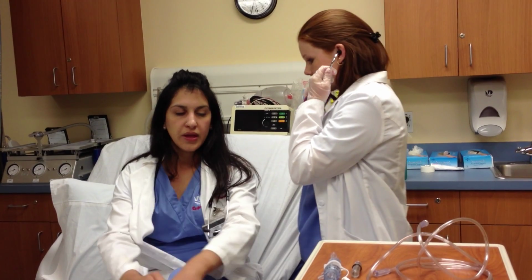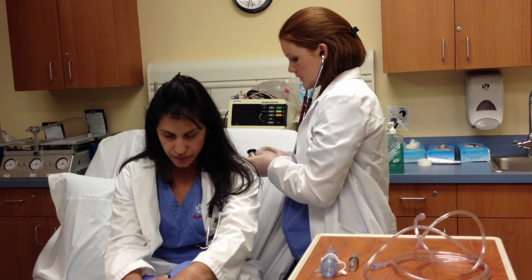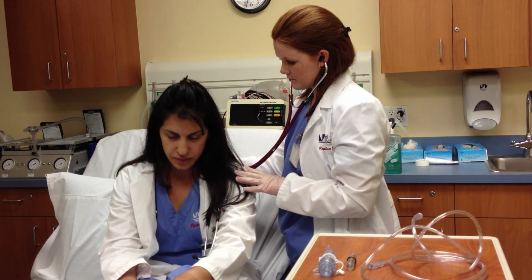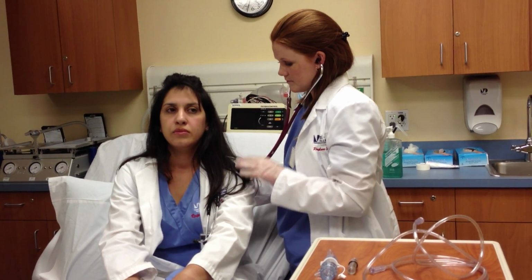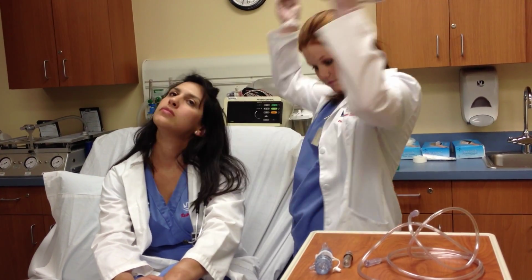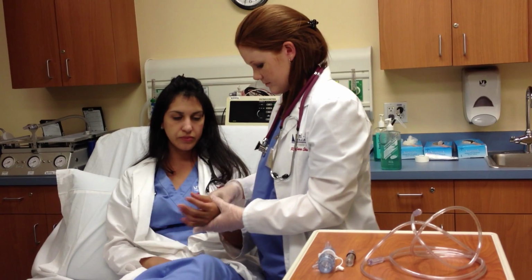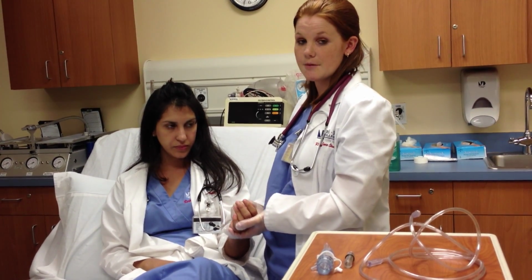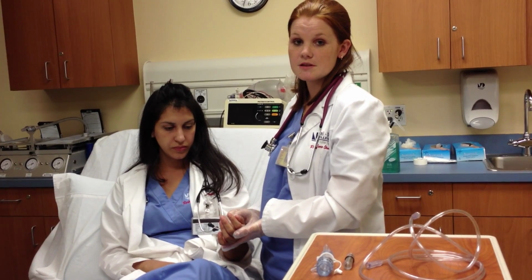You can sit up for me. Breathe in whenever you feel my stethoscope. I'm going to check her pulse for 60 seconds, followed by her respiratory rate for another 60 seconds. I'm going to make note of these because I will be using them for charting later.